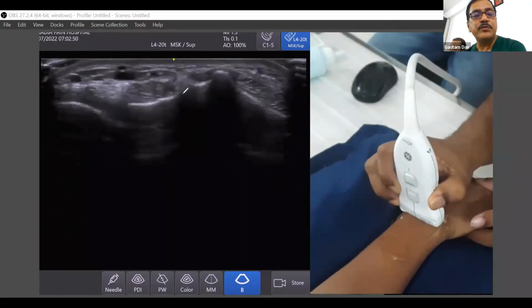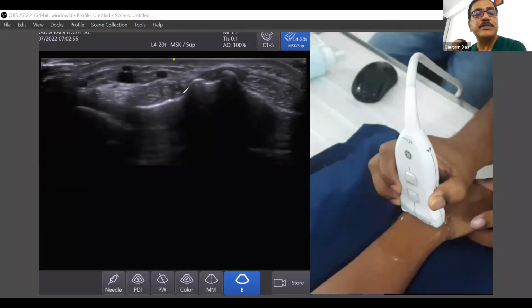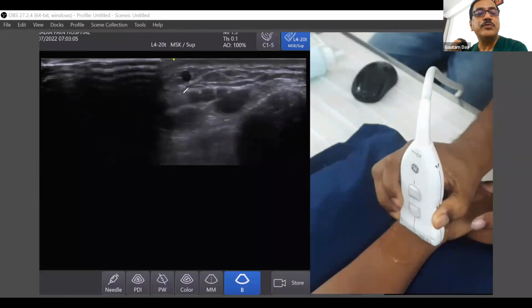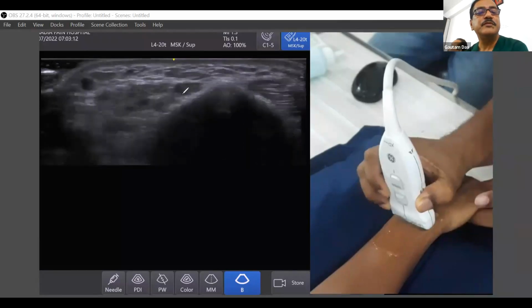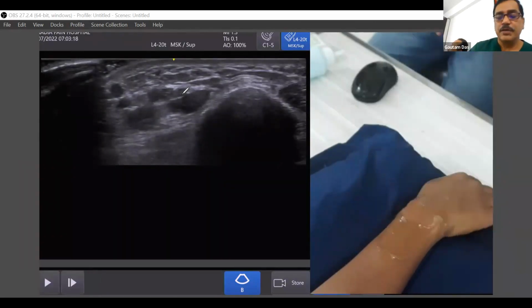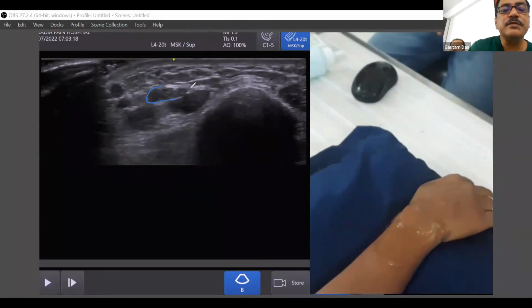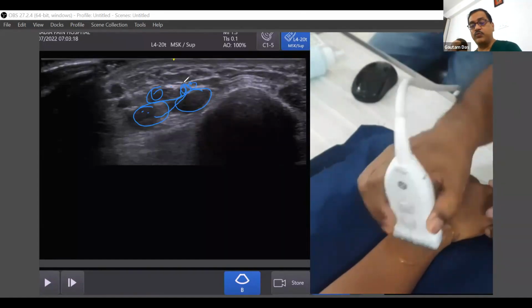And now, see what is happening with the extensor digitorum and extensor indicis. So extensor digitorum here, you see, here the extensor digitorum is best seen, as I already showed. So here, these are the extensor tendons: 1, 2, 3, 4. This is your extensor indicis. You see, gradually this muscle will be becoming tendon, and then these two tendons together will be going to supply the index finger, second digit, and we'll be able to follow it very nicely.